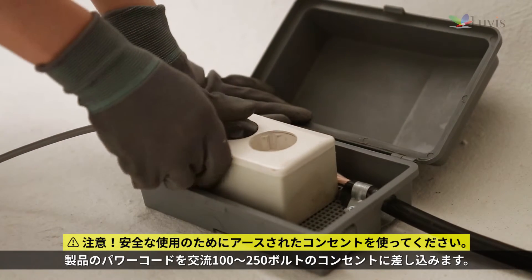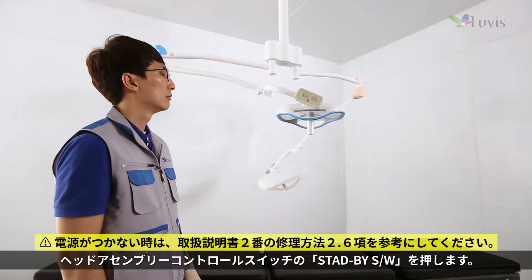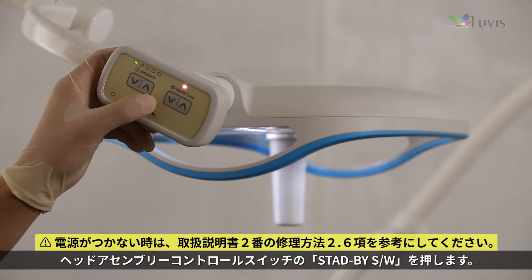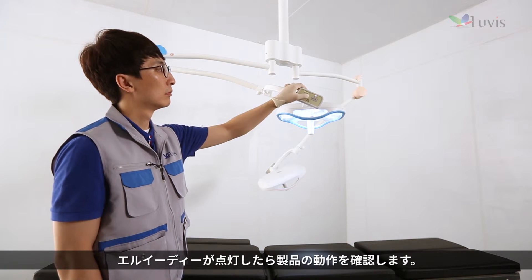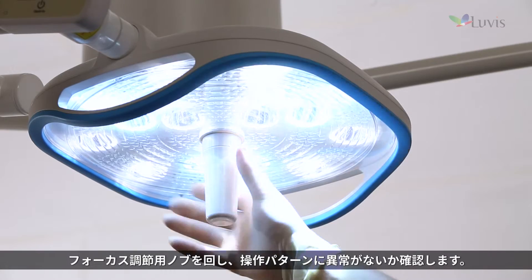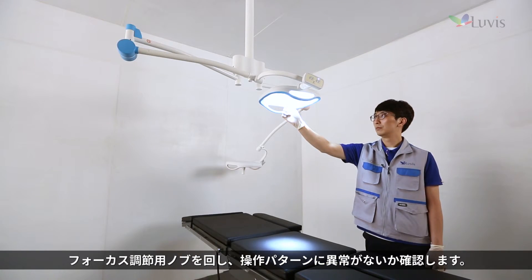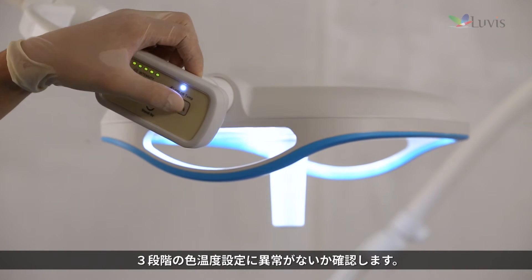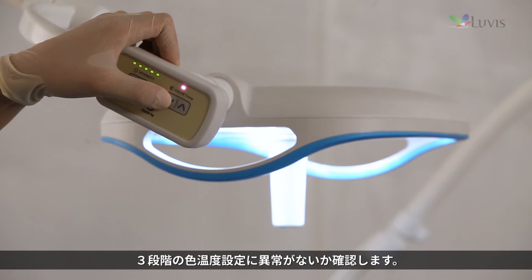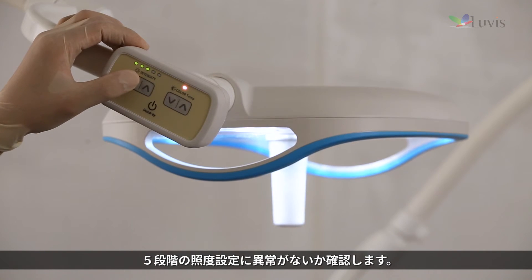Plug the product power cord into an outlet supplied with AC 100 to 250 volts. Press the standby switch from the head assembly's control switch. If the LED light is on, check the product operation. Check for any problems using the inspection pattern while turning the focus control knob. Press the up-down control button and check the three-step color temperature settings, then check the five-step illumination settings.